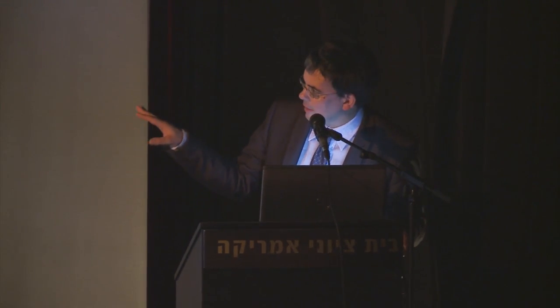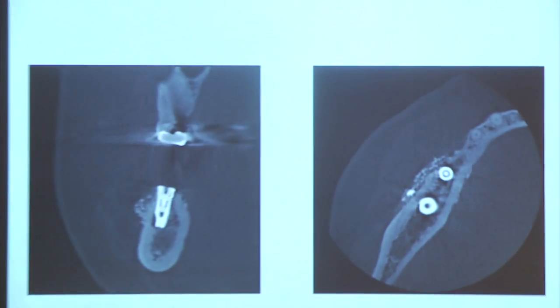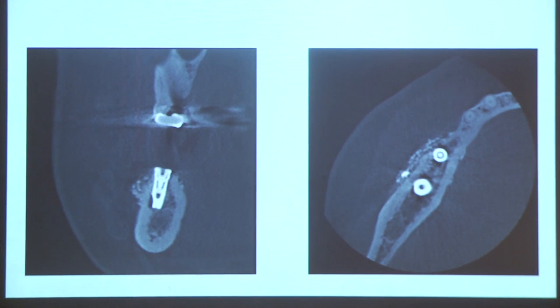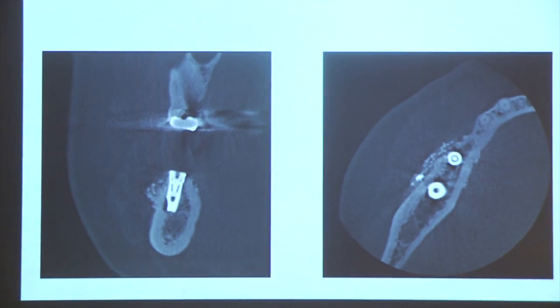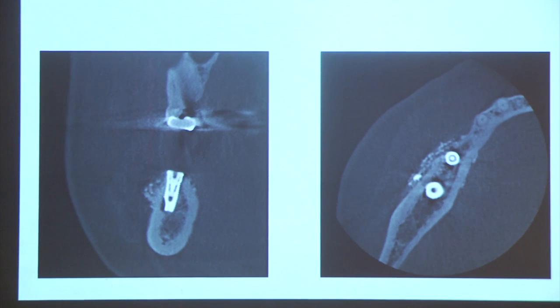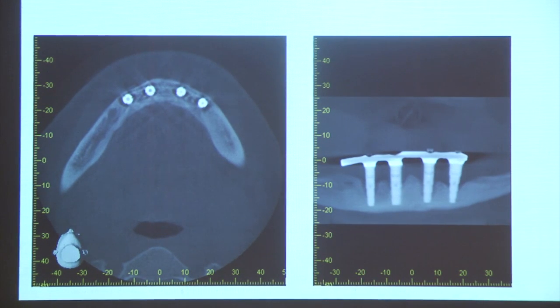This is the principle of drilling guides with implant planning as I showed before. Of course you can use the cone beam scan even after insertion of the implants — the low level of metal artifacts gives you a nice idea about the augmentation area and the position of the implant. And if you have peri-implantitis, you can clearly judge the amount of bone loss around the implants, as shown in this case.